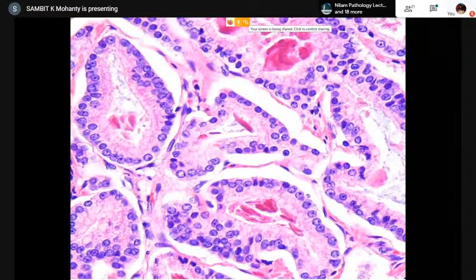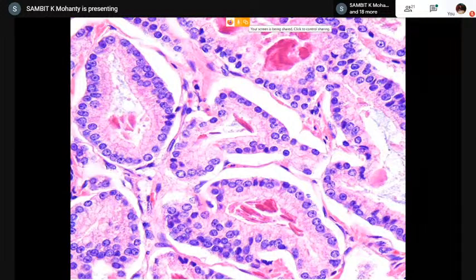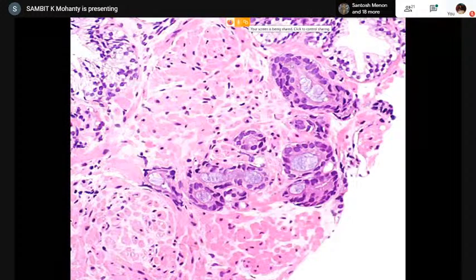So these are basically malignant luminal cells, or the malignant epithelial cells of the prostatic acini, and there is stratification of the malignant cells. This is something called stratification, multilayering of the malignant cells. That also can happen. How about here? You have again blue mucin with multilayering, stratification of the luminal cell, and this is a benign gland.